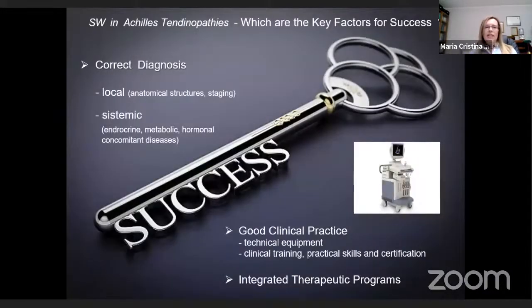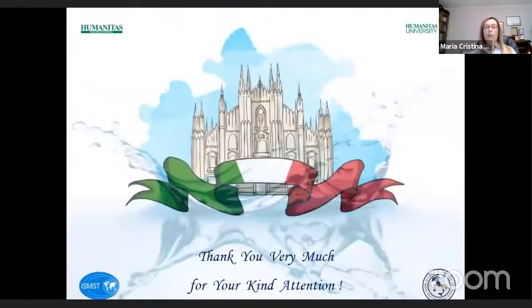The key for success is, first of all, correct diagnosis. You have to be able to localize the site of the disease from a local point of view and from a systemic point of view. You have to follow the so-called good clinical practice rules, so technical equipment, clinical training, practical skills, and certification, and always include shockwaves in a so-called integrated therapeutical program.